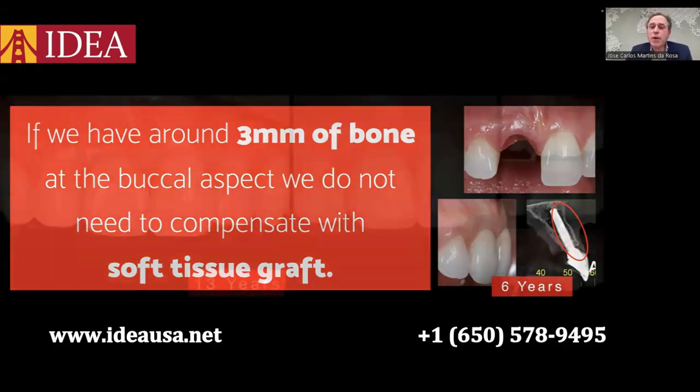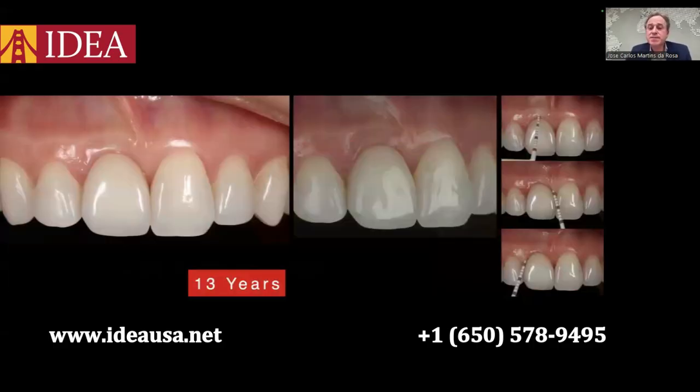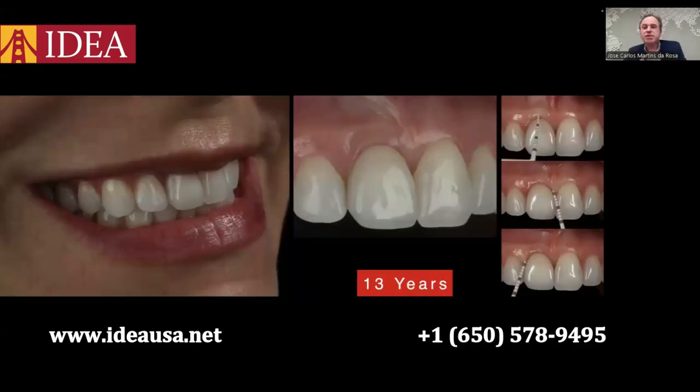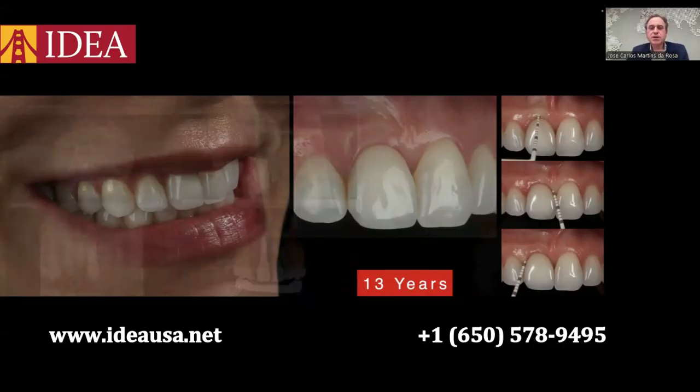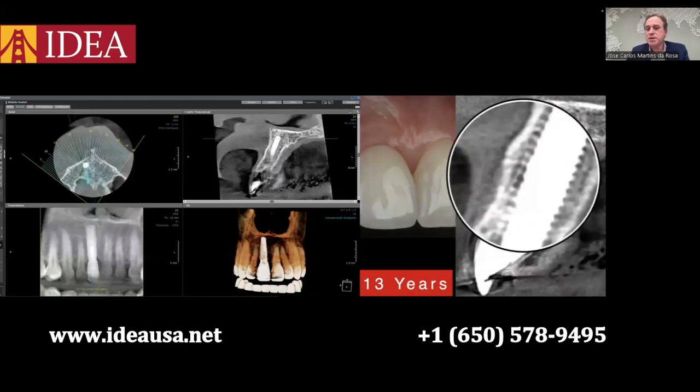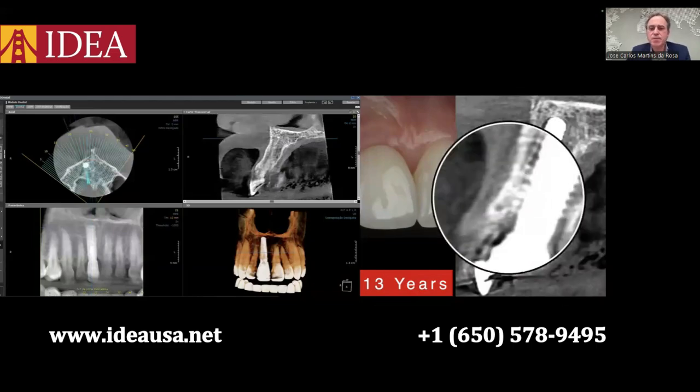So this is the follow-up after 13 years. The gingival architecture is being maintained in its original position. And we still have the balance between the lips, the gingival architecture, and the final restoration. This is what the patients are really looking for. So this is the CBCT scan that was taken after 13 years. And you see here the buccal wall completely remodeled and still stable.